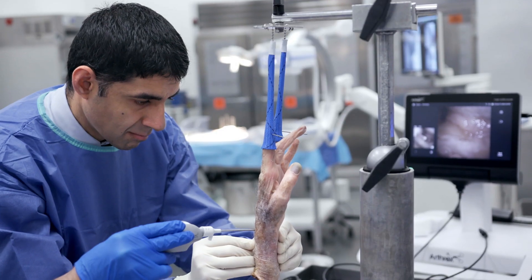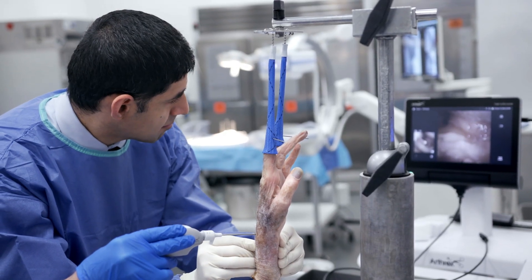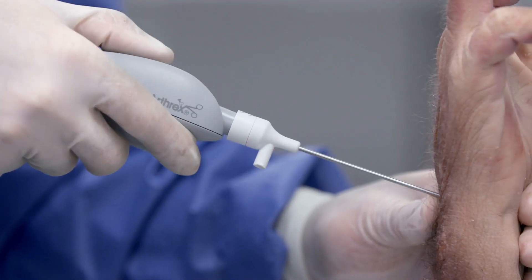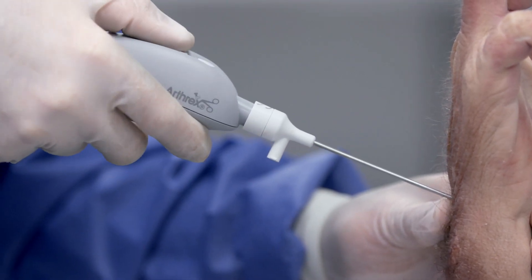The first time that I saw the nanoscope technology I was totally enthused about it. It's like a disruptive technology to orthopedic surgery — not just hand and wrist surgery. It allows us to really expand our indications and what we're doing in a more minimally invasive technique, which ultimately will get our patients back quicker, sooner, and treat them better.